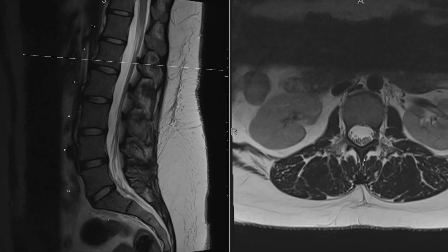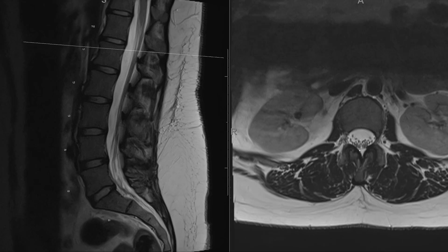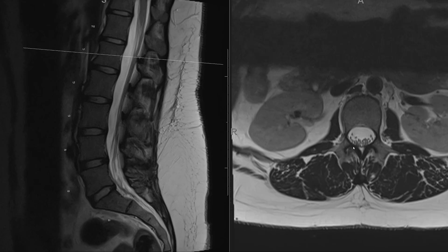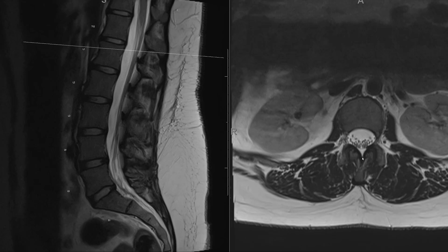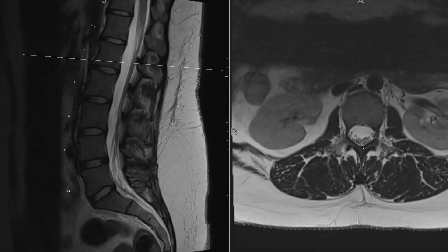The ligamentum flavum runs posteriorly here — it's this dark, thicker band running all the way over the lamina and then over the facet joints out to the foramen. It has a kind of seagull shape to it. As you scroll up and down, you'll see that it's posteriorly located, but then becomes more anteriorly located, which is why it has this undulating contour on the sagittal view.